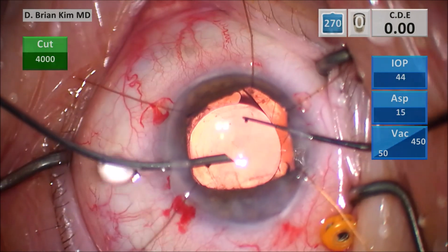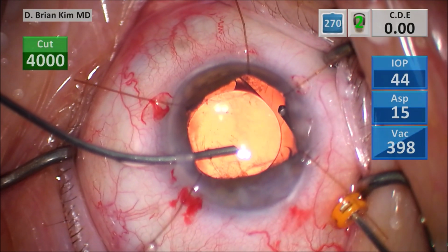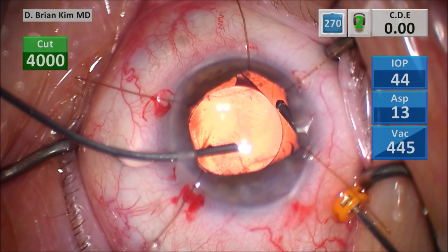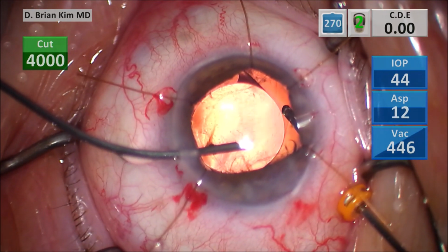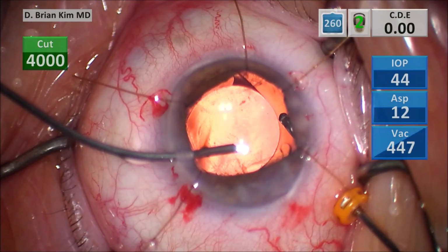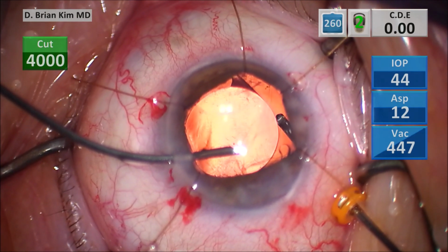You could have done a variety of different choices, but when I was able to open up the bag pretty easily, and despite the fact that this lens was in the ciliary sulcus, again, I was rather surprised, but the key was the posterior capsule was totally intact and there was a localized anterior capsule tear. Just very carefully and methodically just visco separating the anterior and posterior capsules into the capsule fornix.